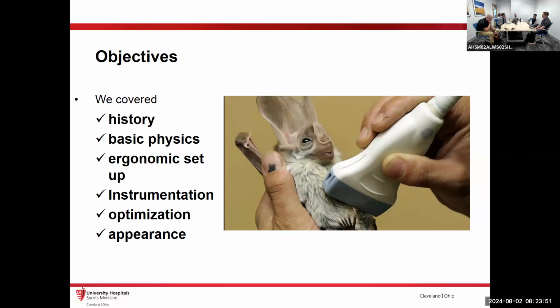But when talking about a $5,000 to $15,000 ultrasound, those are the V scans, those are the handheld ones, the Clarius. Some of the ones that are wireless, the batteries get hot and you don't have a super long charging time. So yeah, if I wasn't clear on that, that's my fault.